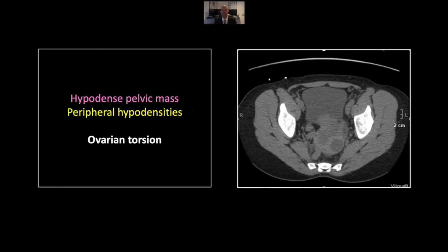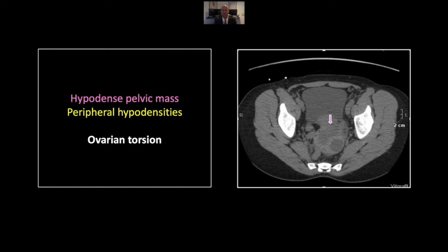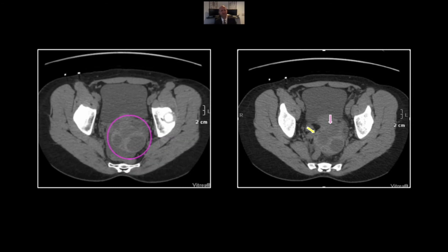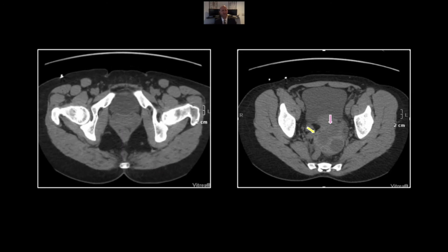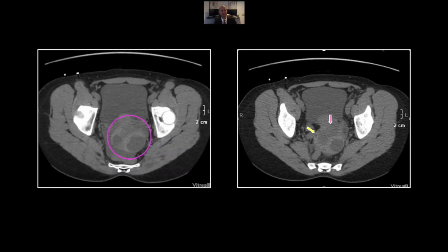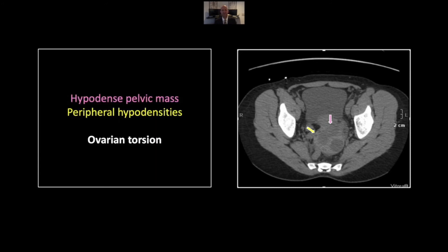Our next case should be familiar to everyone — it's an ovarian torsion. There is a large hypodense posterior pelvic mass, a fairly common location, as these tend to drop back into the cul-de-sac when the ovary enlarges. The critical diagnostic finding here is the peripheral hypodensities that represent follicles displaced to the outer margins of the ovary by stromal edema. Note those peripheral hypodensities in the cul-de-sac, which really let you go right to the diagnosis — very little else will have that appearance. That is an ovarian torsion.